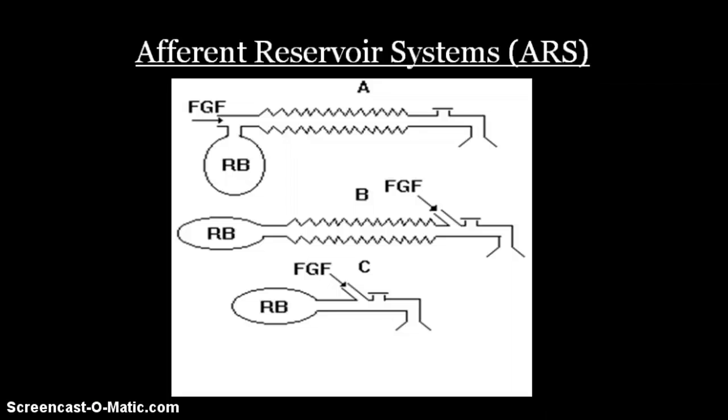If the fresh gas flow inlet is close to the expiratory valve, as it is in the Mapleson B and C, the system is inefficient during spontaneous and controlled ventilation. The efficiency is a function of carbon dioxide elimination and fresh gas flow utilization, which is compromised by this arrangement of components.